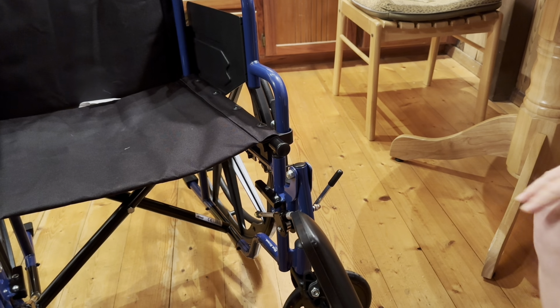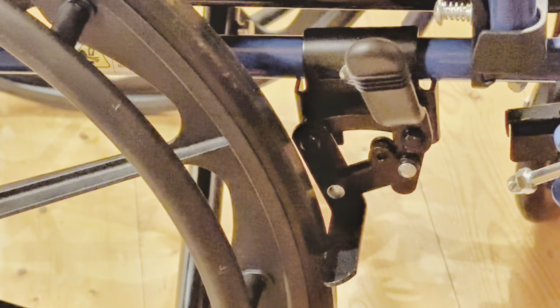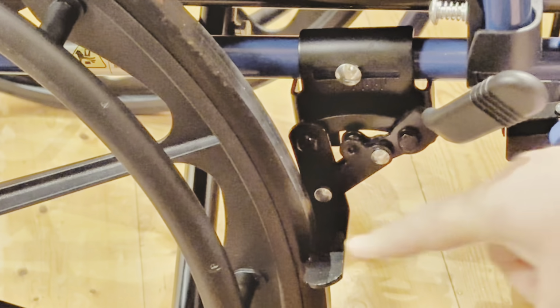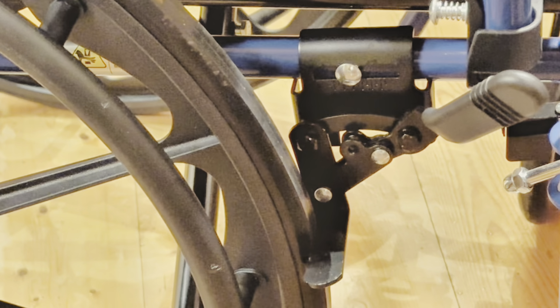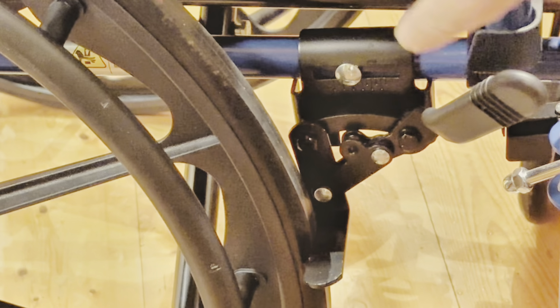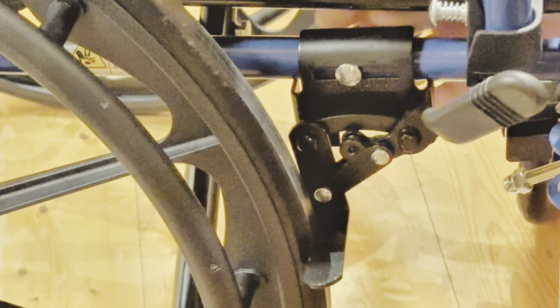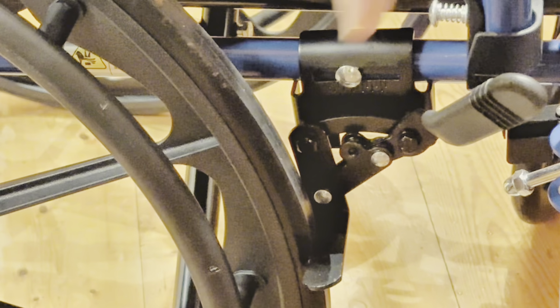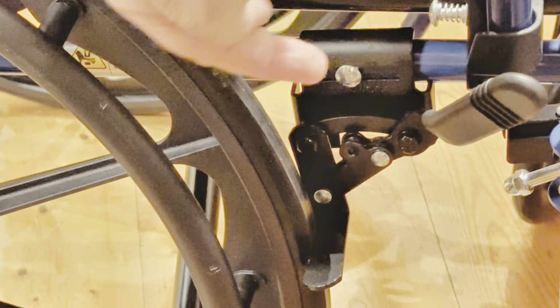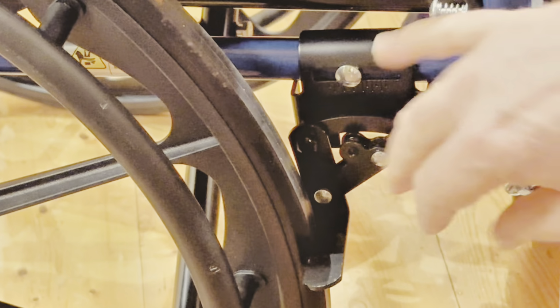Okay. So my other complaint, let's do a close-up on that. Not the best lighting, but when you lock it, it really presses into the tire. Like, I mean, you know the tire's not gonna roll, but it just seems so excessive. So I noticed there's a carriage bolt with a nut on the other side where my finger is, and you can actually undo that, and then you can slide the locking mechanism a little more this way so that the brake is not so hard to put on.